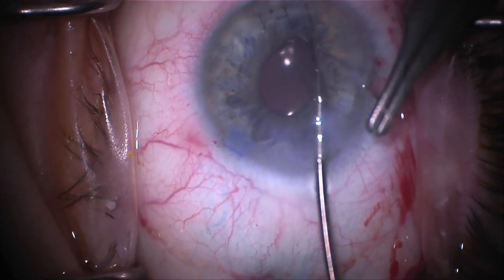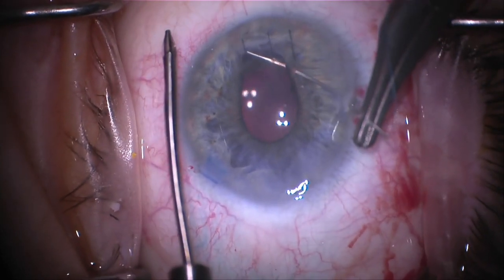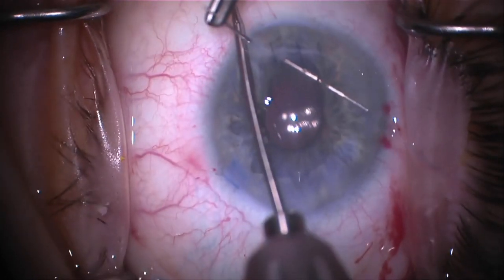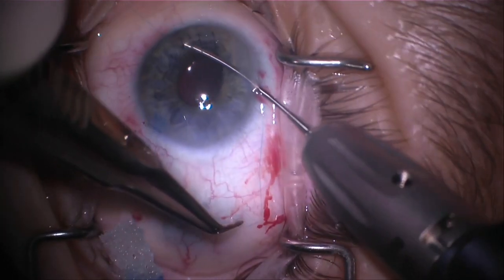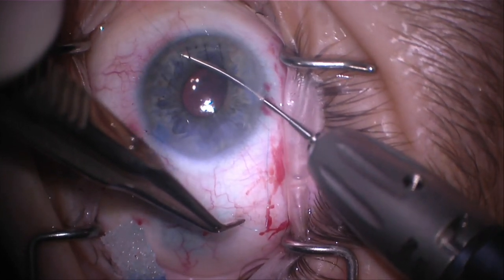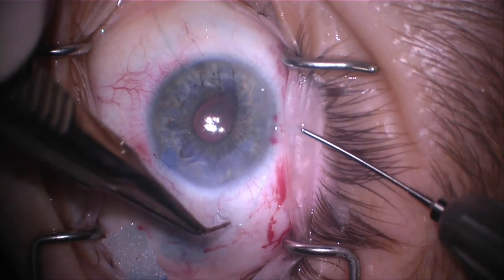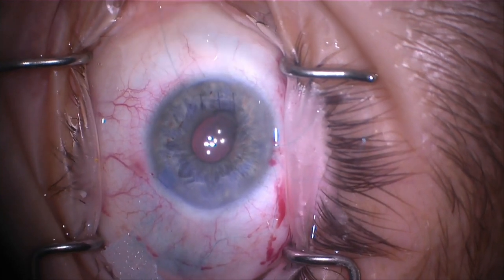Just like in the paper plate, through a paracentesis, we're taking our 10-0 polypropylene suture — this is a CIF-4 needle. There go the proximal and distal portions of the iris defect. We're just going to push the needle right through the limbus. In this case, I don't have an exit wound or exit paracentesis. We'll go back and recover our suture. Remember, it's so important to have your sutures lined up — strand one, two, and three. I'm actually holding onto the free end of the suture to make sure I don't mistakenly pull it into the eye. I'm using the condon snare — that little latch hook device — to help recover the suture.